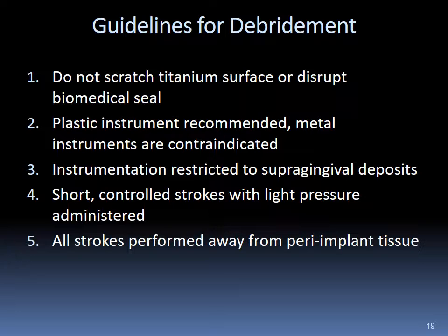Guidelines for debridement of dental implants include the following. Do not scratch the titanium surface or disrupt the biological seal. Use only plastic instruments. Metal instruments are contraindicated. Instrumentation is restricted to supragingival deposits only. Use short, controlled strokes with light pressure, and all strokes should be performed away from peri-implant tissue.